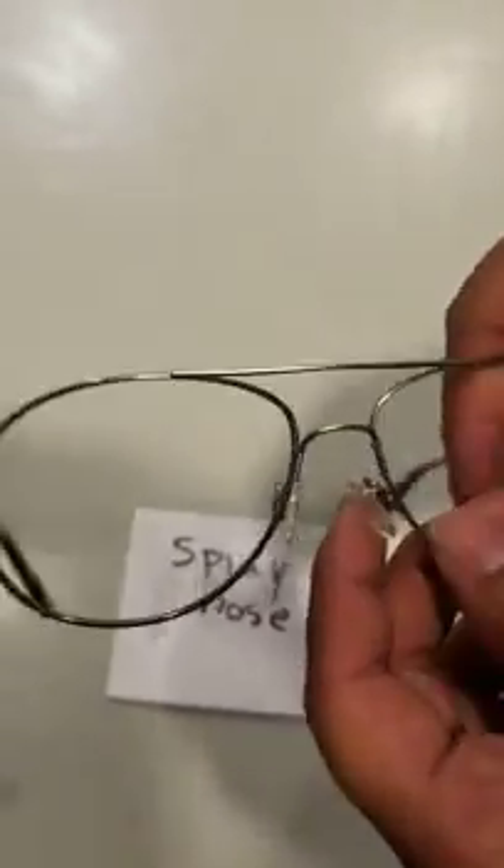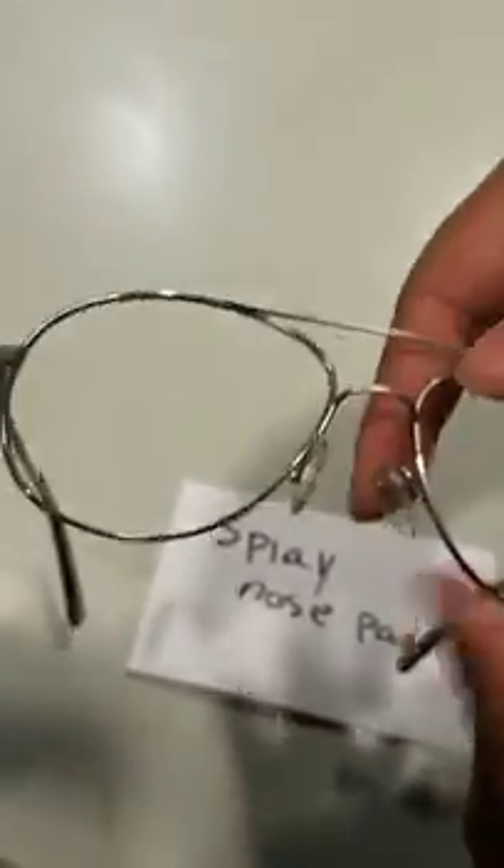The angle I'm going to be showing is the splay angle, and as you can see right now the nose pads do not have any splay angle. The effect it has on the patient is when the frame doesn't have a splay angle, it can either hit the back of the nose or the front.